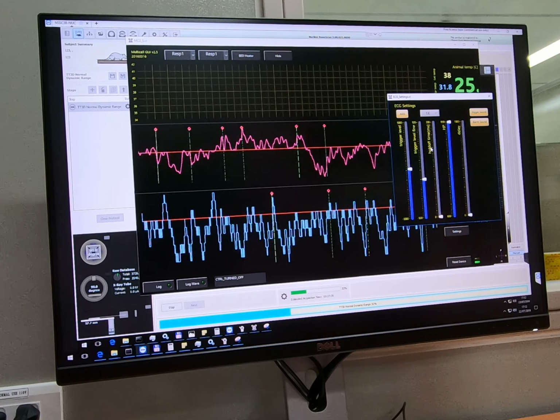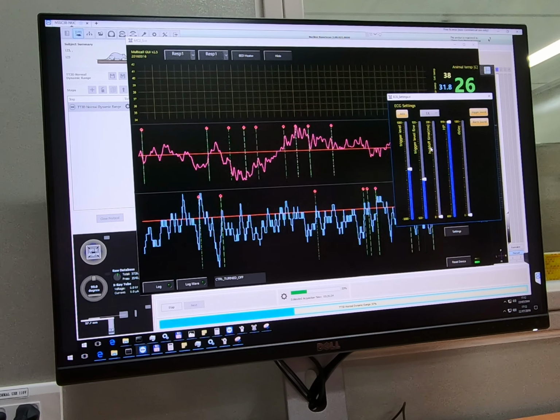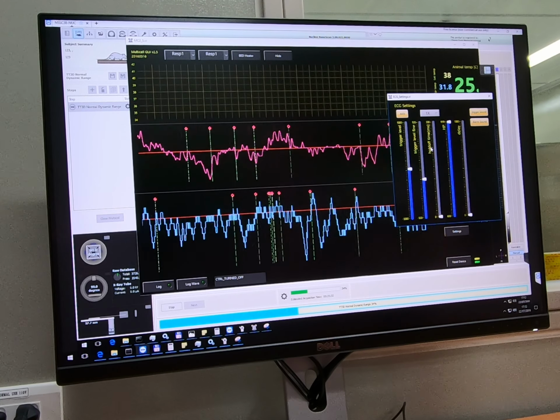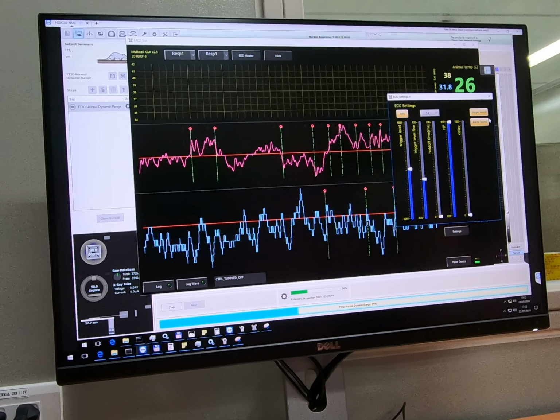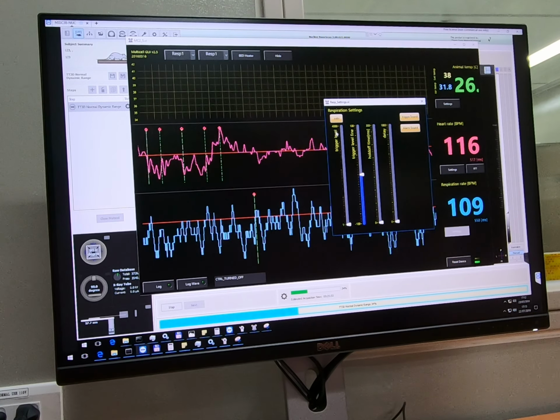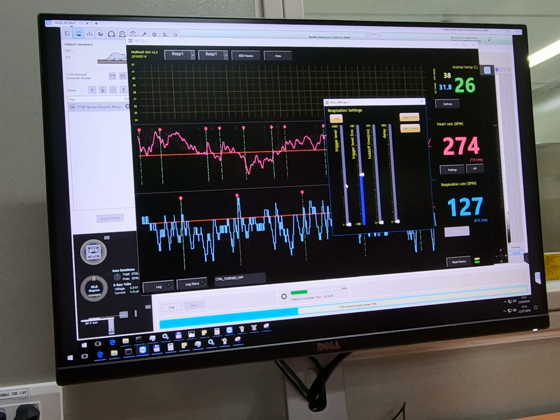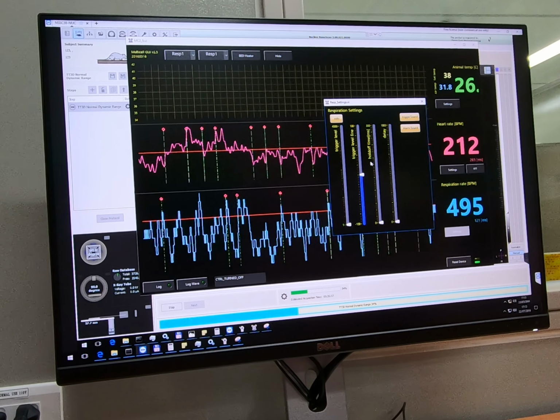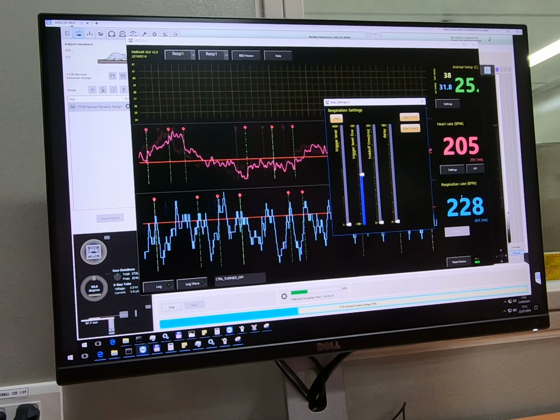I mean, it is usually useful for respiratory gating, because the ECG signal is so high and so regular that it is not really affected, but the respiratory curve can be highly affected by the heartbeats. The setting seems the same for the respiratory rate as well. So we also have the rough slider for the threshold and the fine slider for the threshold modification, and also the hold off. The hold off sometimes is useful when you do a respiratory gated scan.